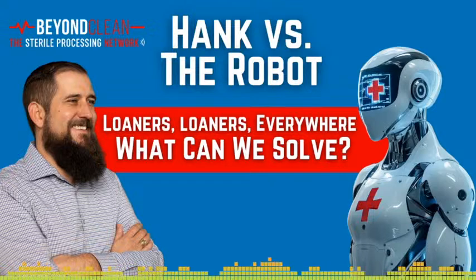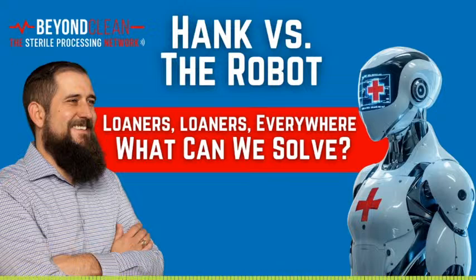A lot of things involved there, but let me start just on that delivery piece. Historically, sterile processing has been asking to get our loaner trays delivered to us from the vendor 24 to 48 hours ahead of time, and yet there's a lot of issues that go into play with that not happening. Can you speak to maybe some of the reasons why that's such a hard standard to meet on the side of vendors, and also why we need that in sterile processing to effectively do our job?